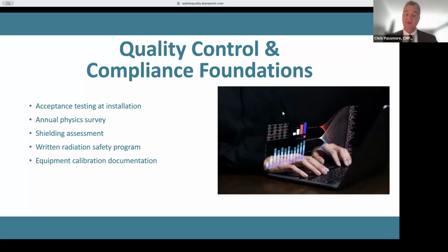And a lot of times the situation 5 years ago, 10 years ago has changed because now your practice has been more successful, or you've brought new technology in where people are getting exposed to levels that they weren't before. For example, 11% of modern dental professionals have a measurable annual dose. I'd say 5% exceed 100 millirem, and about 1% exceed about 500 millirem.